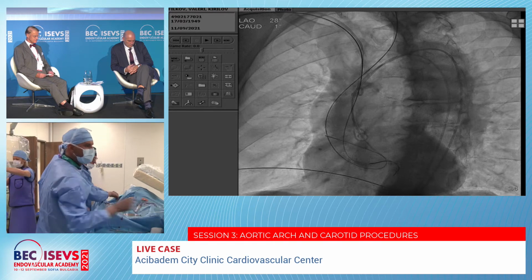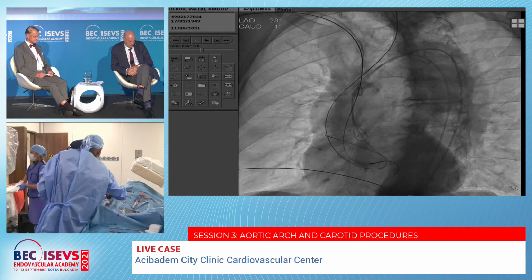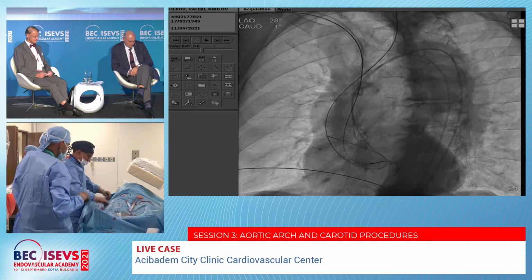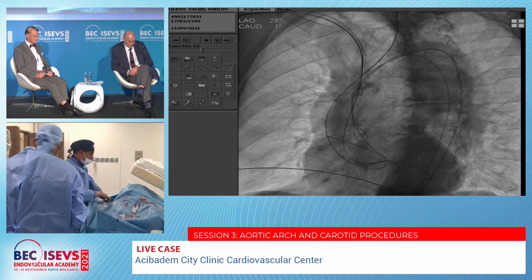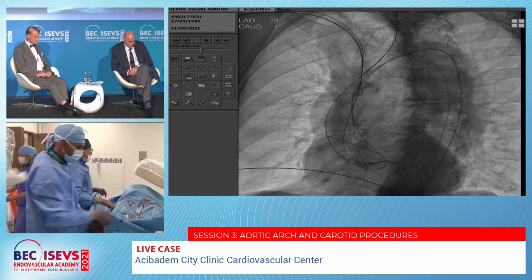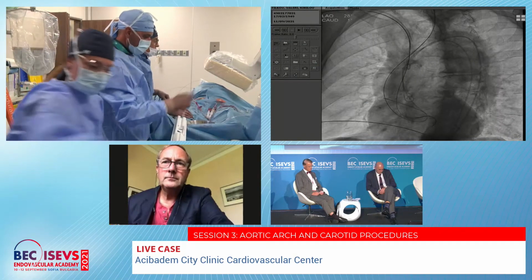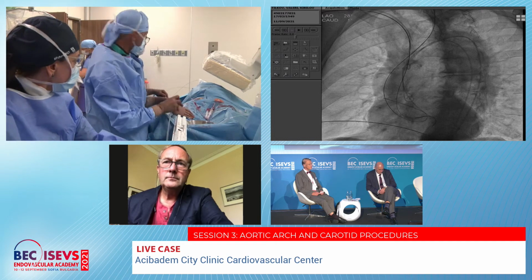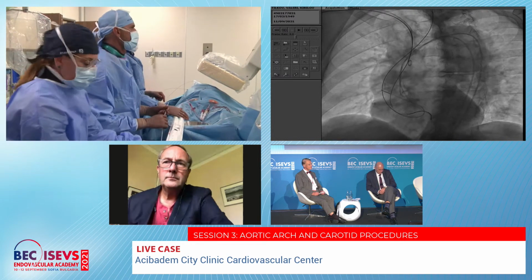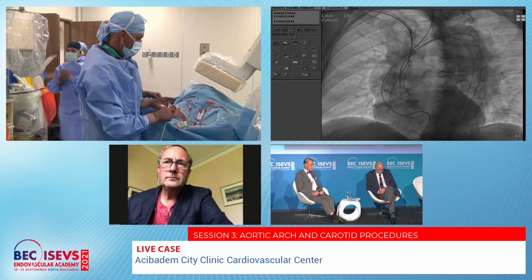And for angio we have placed the second femoral approach. In fact, we have 6 vascular accesses: both femoral, 1 carotid, the left one, 1 subclavian, the right one, and 1 radial, the left radial artery, because we are planning again to occlude the left subclavian artery, because it's originating from the aneurysm.